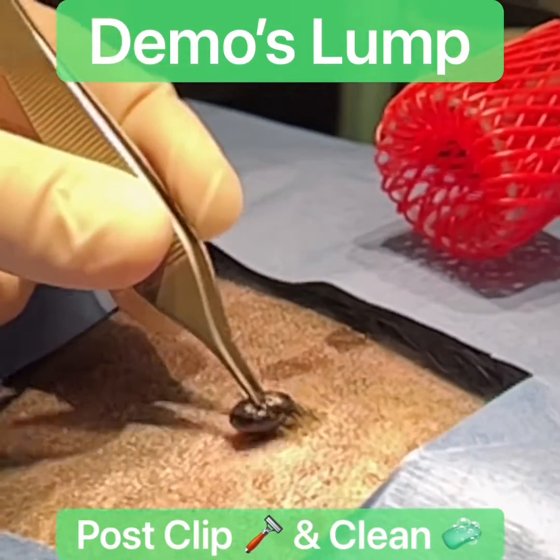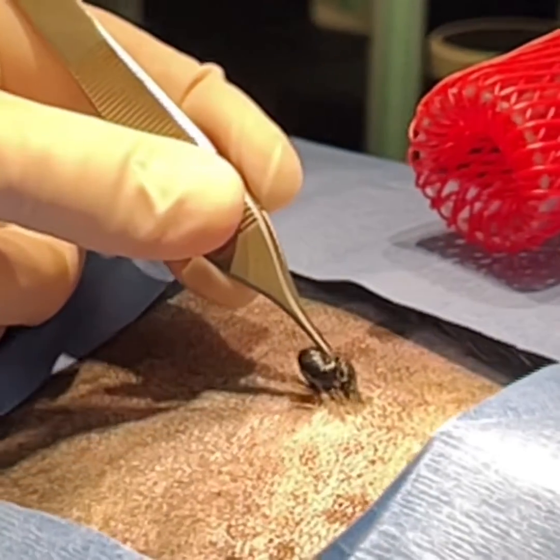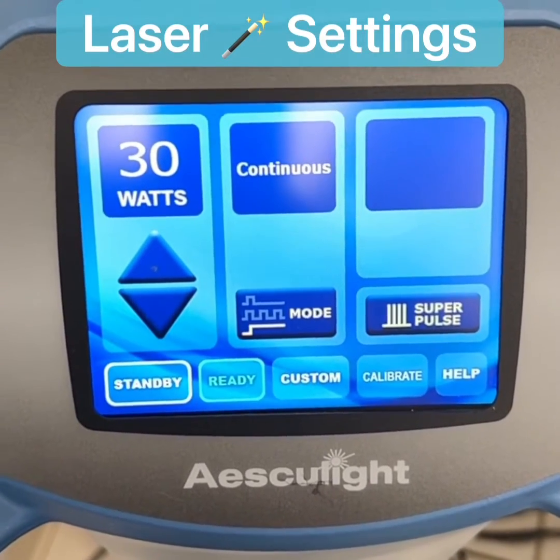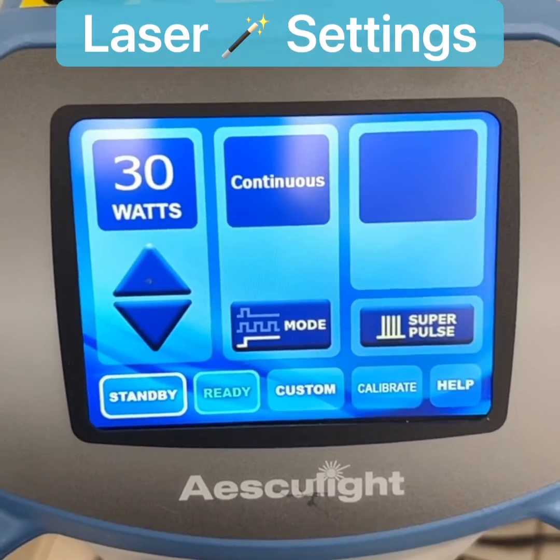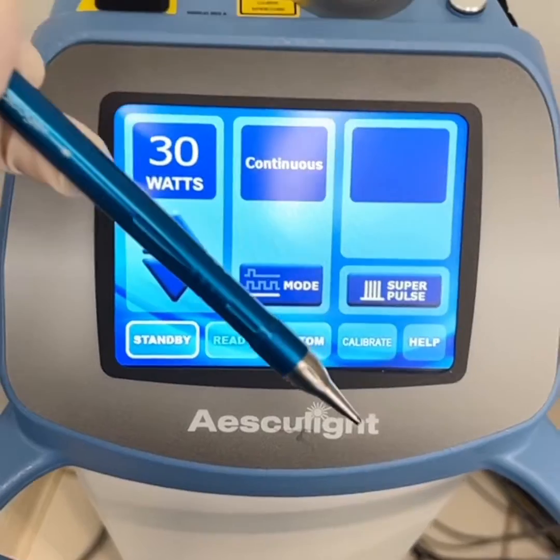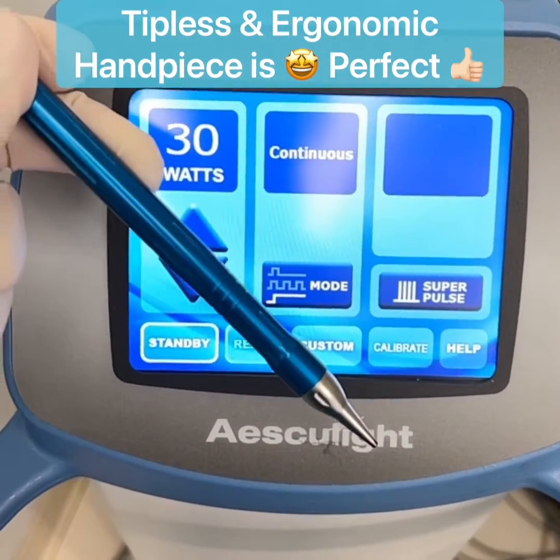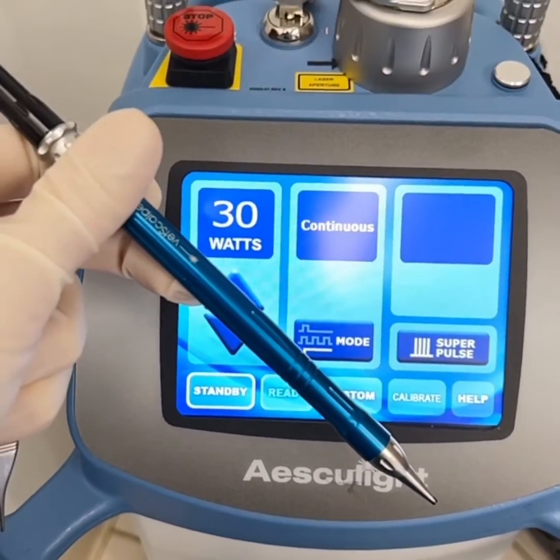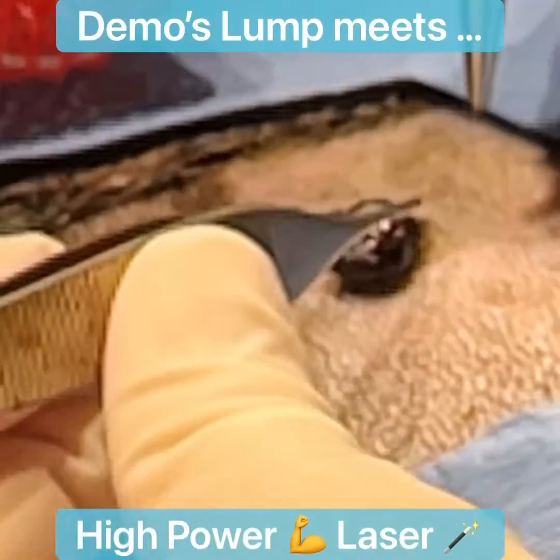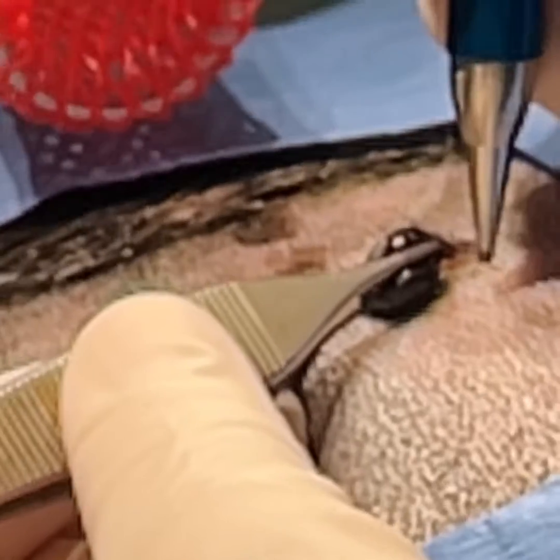Here you can see the lump on his back that we're going to be removing with an elliptical incision using the CO2 laser. We're using 30 watts on the Aesculight in super pulse mode with continuous. Here is the newer ergonomic handpiece — a tipless laser, which is great because we don't have to worry about cleaning or sterilizing tips. Now we're going to go ahead and use our laser to make an elliptical incision around this lump.